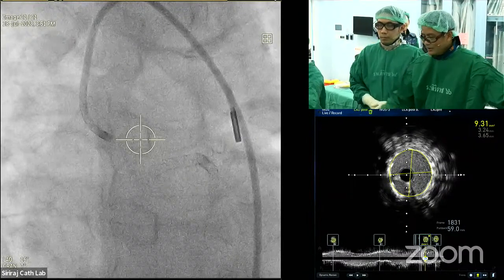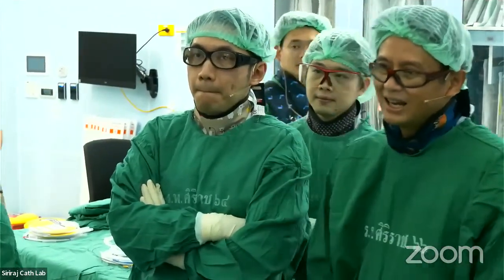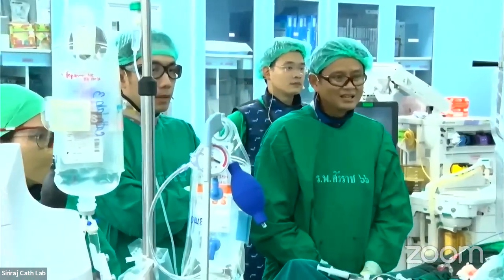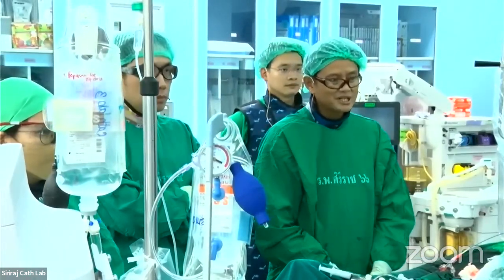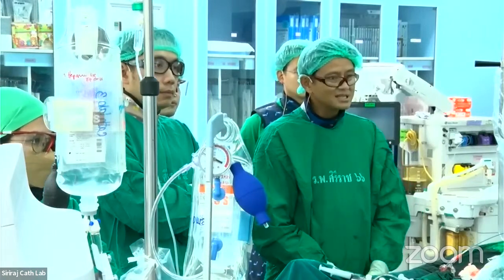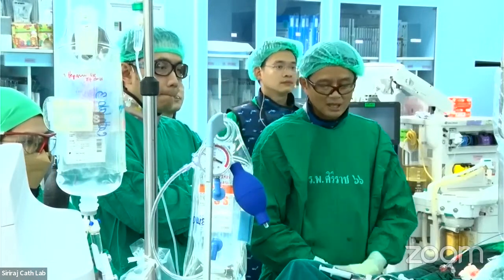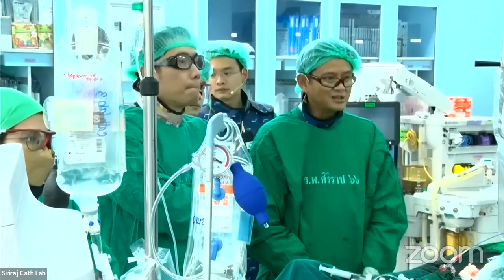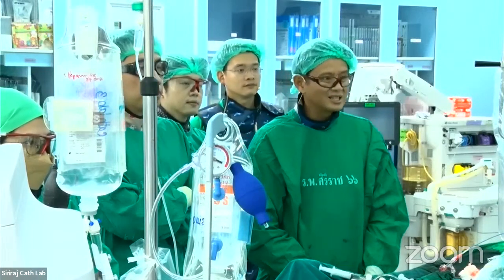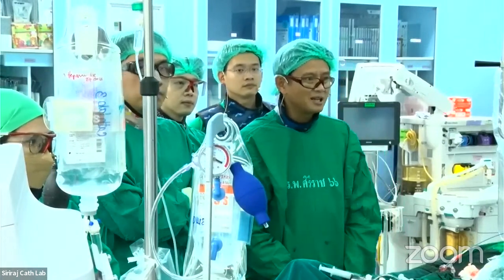Okay, so thank you, Jack. First, I have to thank all the moderators and panelists for helping us, thinking together and working as a team to do this complex, challenging case. So I think this is a true CHIP PCI. When you do PCI, you need to identify the patient's risk first. And when we saw this case as a replacement for the first case we had, we had some doubt because the EF is 20. But as you can see, how important GDMT is, and usually when the patient has ischemic cardiomyopathy with LV dysfunction, I think that is very key before you do PCI. I think you need to optimize this medication, then make them more tolerant.